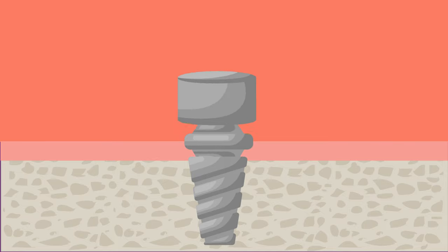The snap happens when the denture is pressed gently onto the head of the implants, which provides a removable solution that you'll be able to snap on and off as many times as needed.